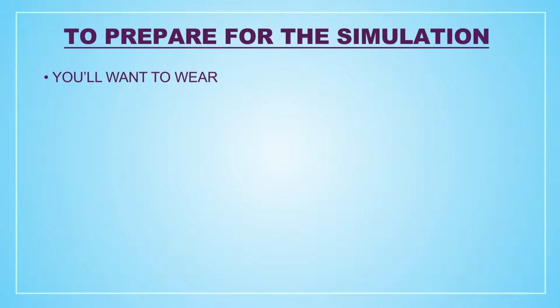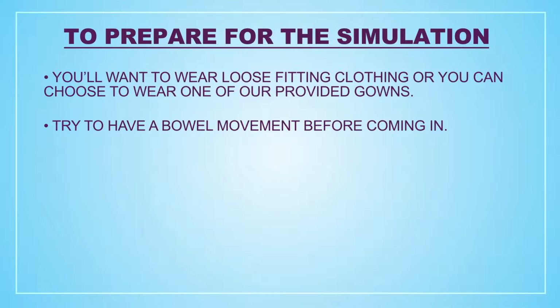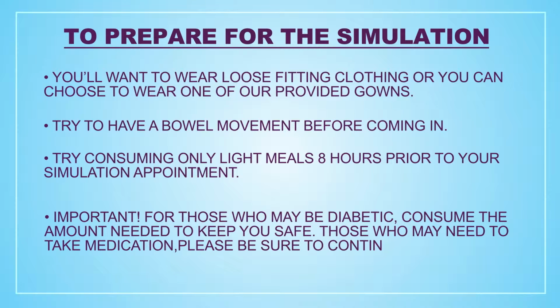As a whole, your CT simulation appointment should last for about 1 to 3 hours, depending on what your doctor has requested. To prepare for the simulation, you'll want to wear loose-fitting clothing, or you can choose to wear one of our provided gowns. Try to have a bowel movement before coming in. Try consuming only light meals 8 hours prior to your simulation appointment. Important: for those who may be diabetic, consume the amount needed to keep you safe. Those who may need to take medication, please be sure to continue taking those medications.